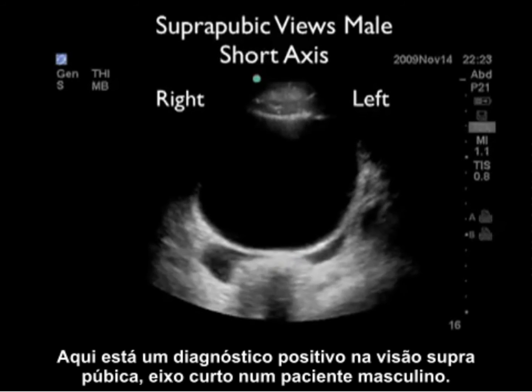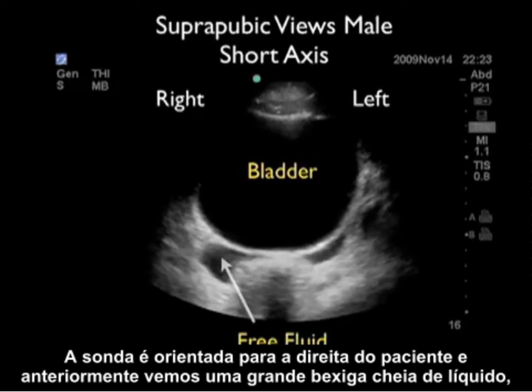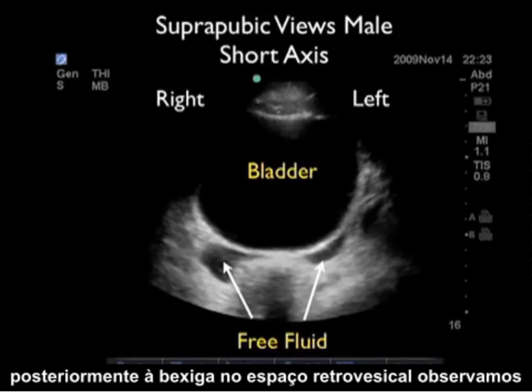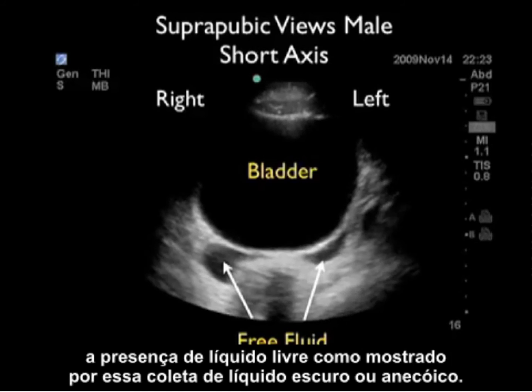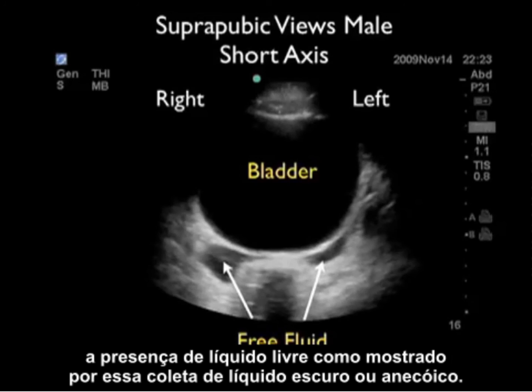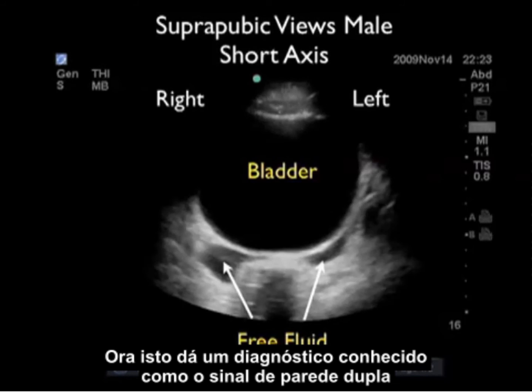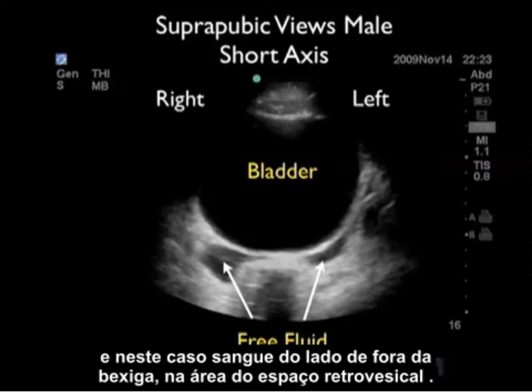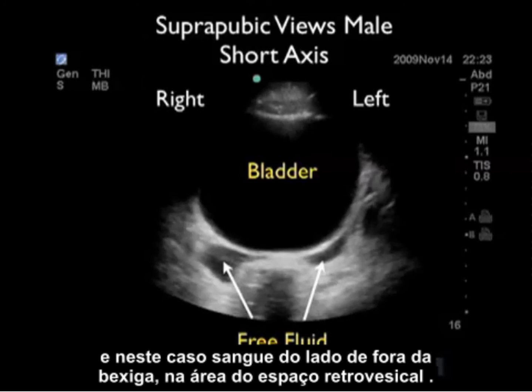Here's a positive examination, suprapubic view, short axis in a male. The probe is oriented towards the patient's right, and anteriorly we see a large fluid-filled bladder. Posterior to the bladder in the retrovesical space, we appreciate the presence of free fluid, shown by that dark or anechoic fluid collection. This gives a finding known as the double wall sign — we see the wall of the bladder outlined by the urine inside the bladder and the blood outside the bladder in the retrovesical space.